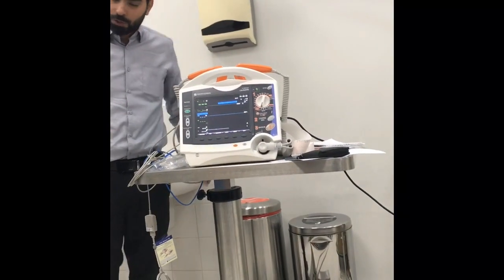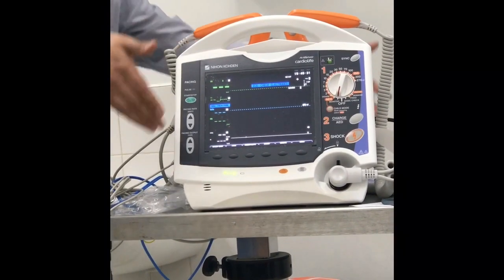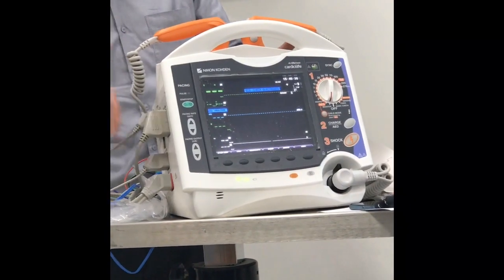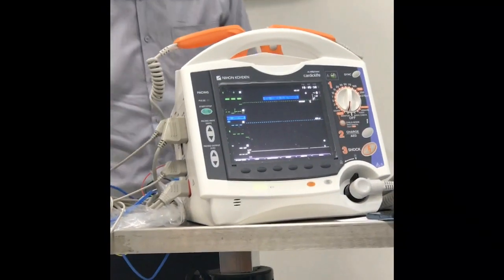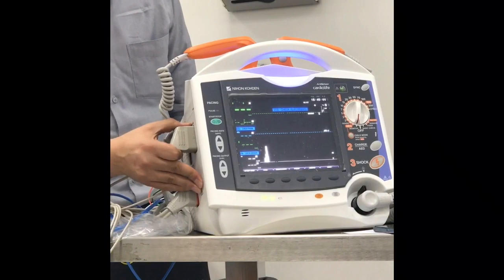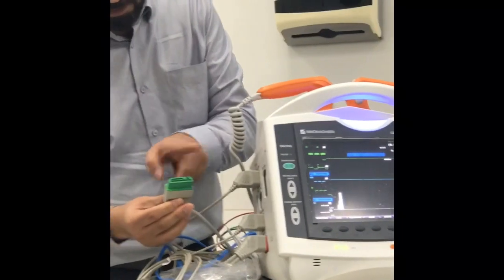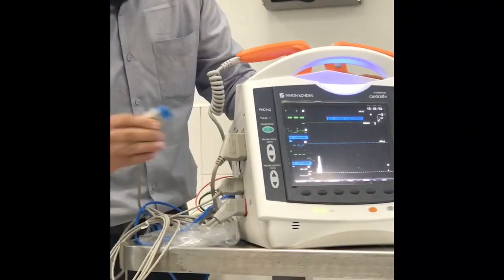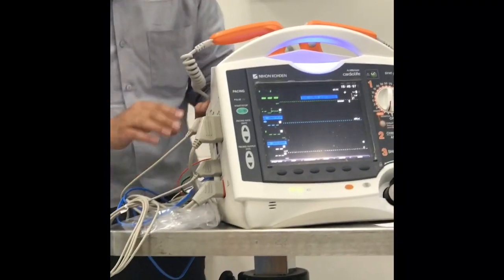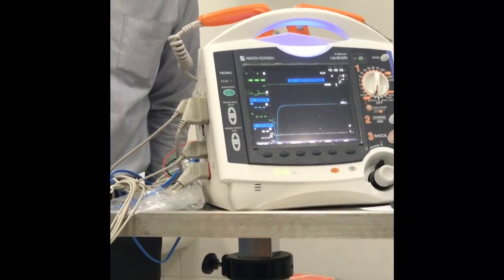So that is why I'm going outside, to know what parameters you have, then we will go to the software and how to operate the system. From the right side, or let's say the side view, as I mentioned before, you have color-coded parameters. ECG is green, so I have to connect to the green. The blue one with the blue; I cannot connect it with the yellow. So color coded: ECG, SpO2, ETCO2, and IBP. Do you need more parameters, or is that fair enough?